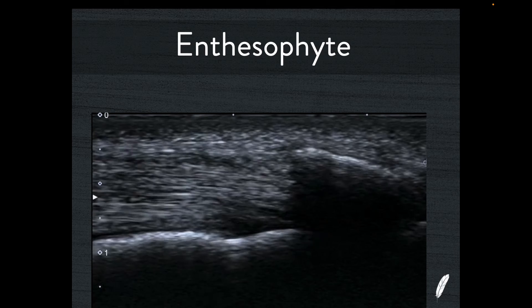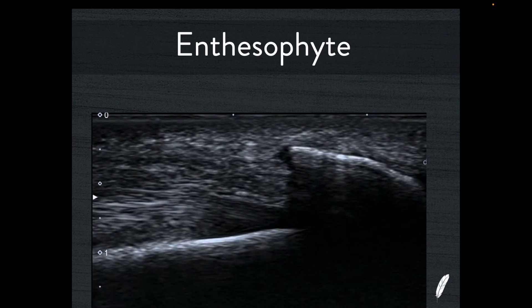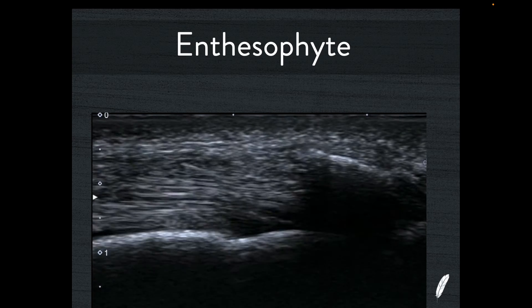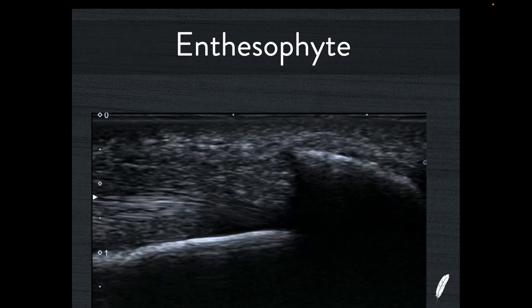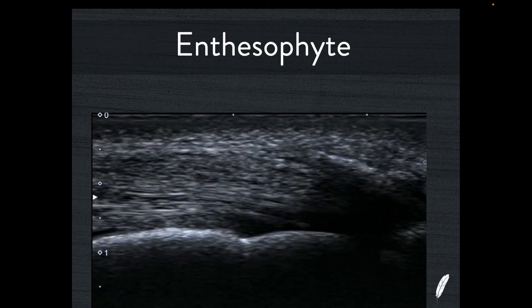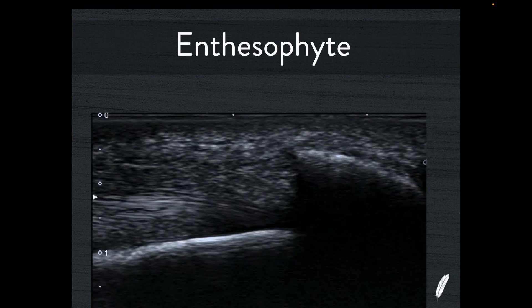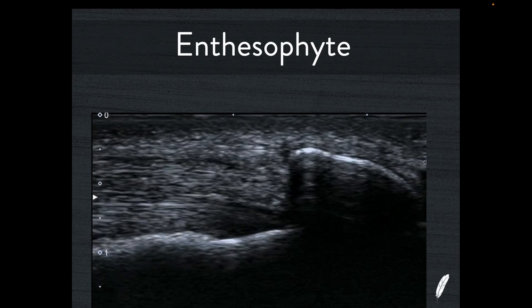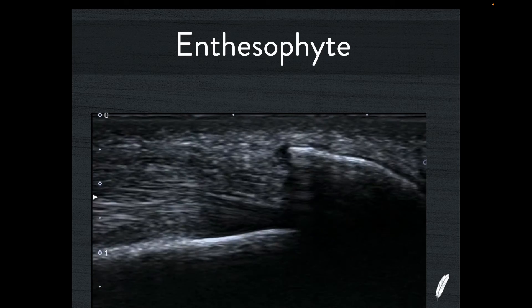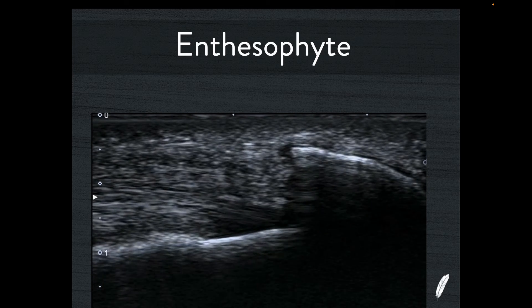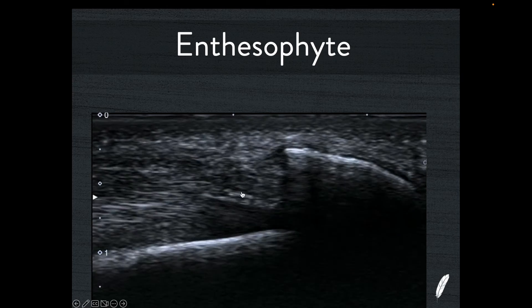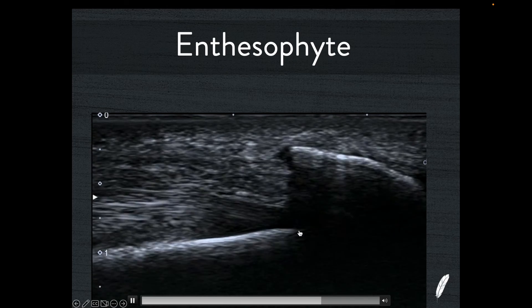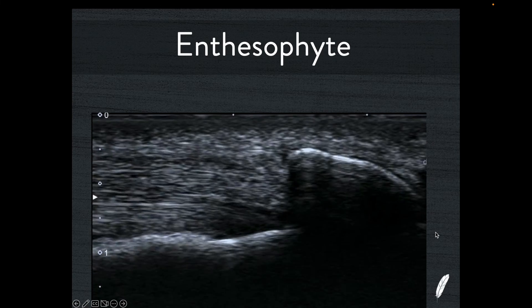Just to show some alternatives: this is an enthesophyte — really bone density, coming directly from the enthesis, a bone spur growing into the tendon representing breakdown between tenocytes and osteocytes. You see these very commonly in seronegative arthropathies such as psoriatic arthritis. It's very dense with a dense acoustic shadow — it looks nothing like the patient we've been discussing.